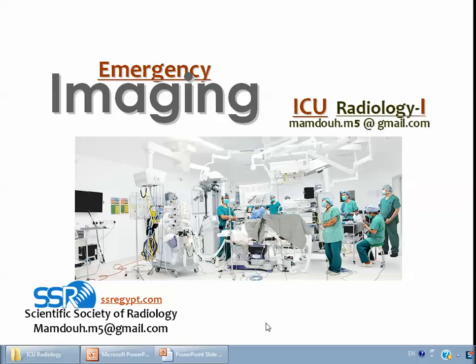Dear colleagues, this lecture is about intensive care radiology, with particular emphasis on the role of examination of the chest by different modalities in ICU patients. The topic will be handled in two parts.